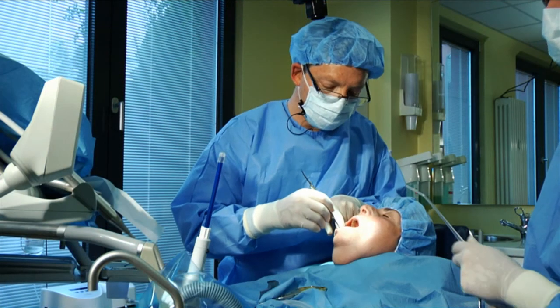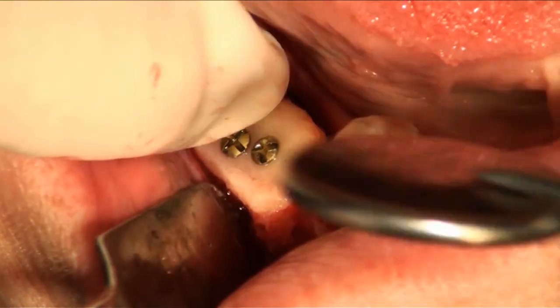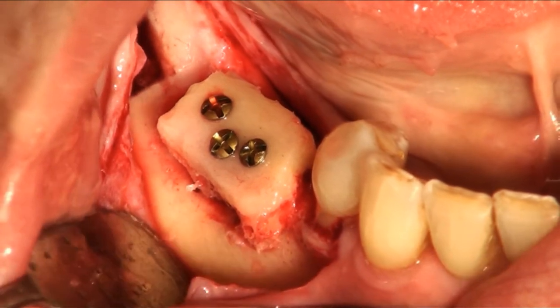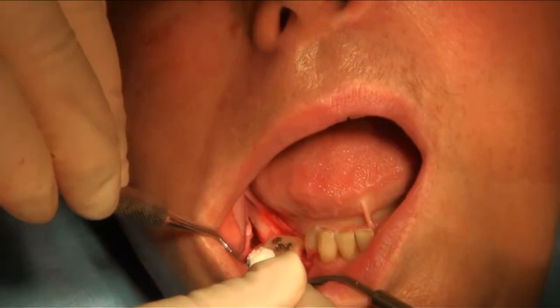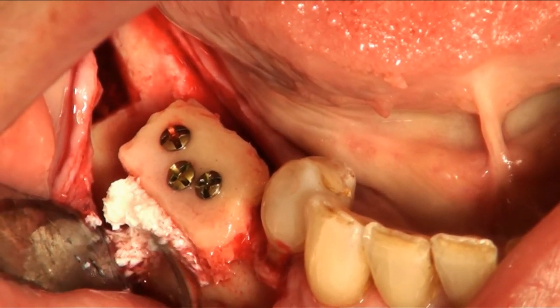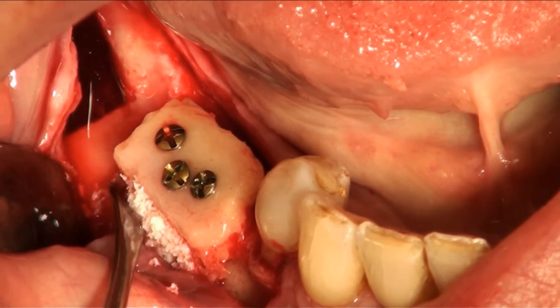Now we fixed the bone block with 3 fixation screws. It is absolutely stable, and it is really very precisely in space. Although we will add some bio-oss material, some deproteinized bovine bone mineral.